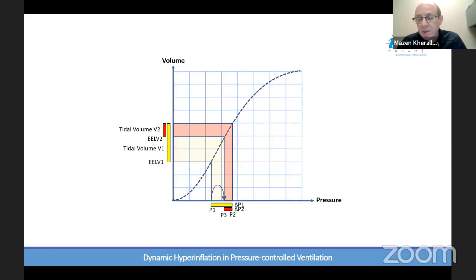Because the added PEEP is actually added to the circuit, and when it comes in touch with the auto-PEEP that is in the alveoli, there's no way it can push it up. So you equalize the pressure between the alveoli and the airways. The added PEEP will function as a way to equalize the pressure inside all the inspiratory circuit.